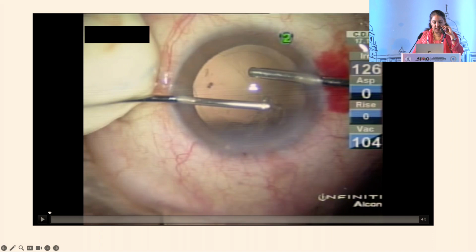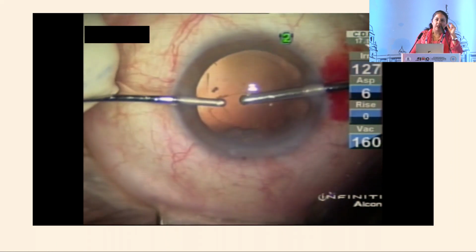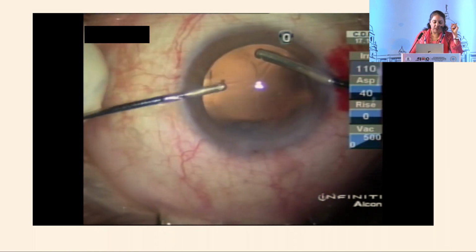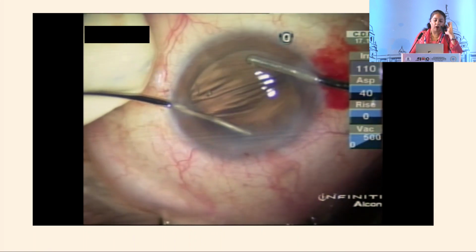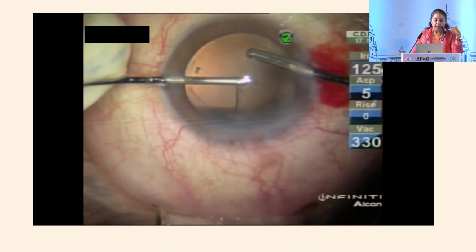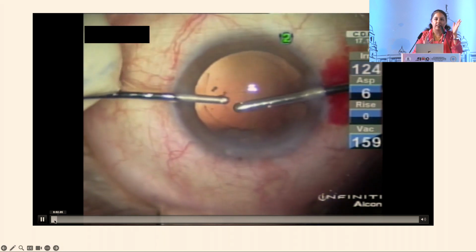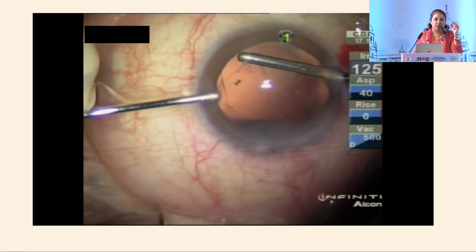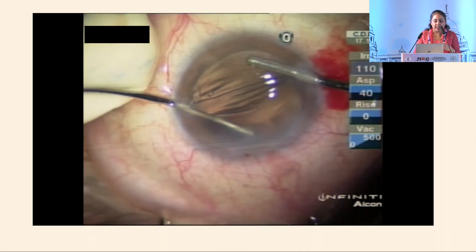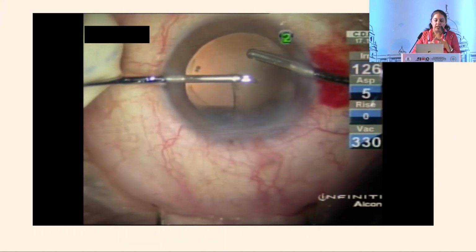Moving on to another case, this is to show you that sometimes when we face vitreous, we just don't change our mindset and we are trying to wish it away. This is a surgeon who's faced a vitreous, uncomplicated cataract, the rhexis has extended and that has caused a PC tear. What is happening in this case is that the surgeon is using the IA to actually manage the vitreous. Please note that the vitreous has various components. It has collagen, it has hyaluronic acid. So though you're able to suck the hyaluronic acid, the collagen will plug your aspiration ports and your phaco ports.